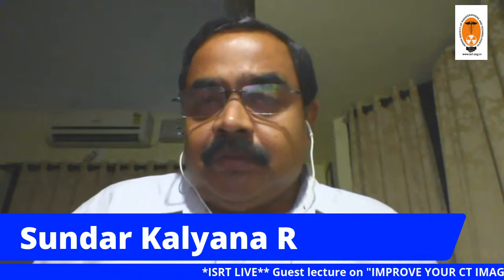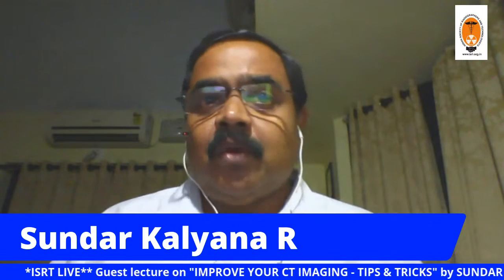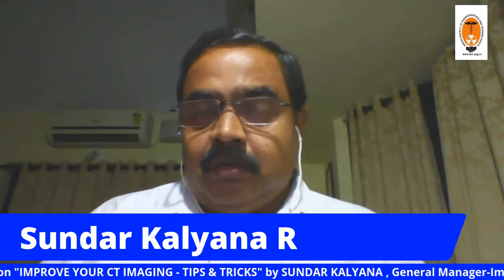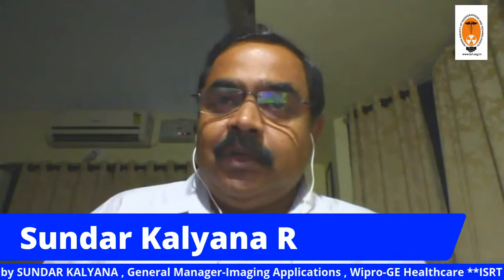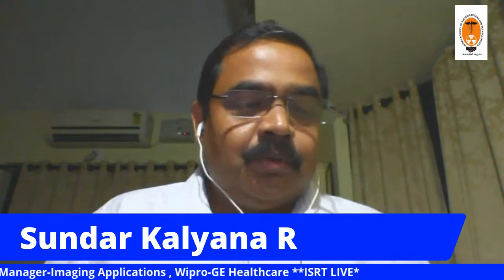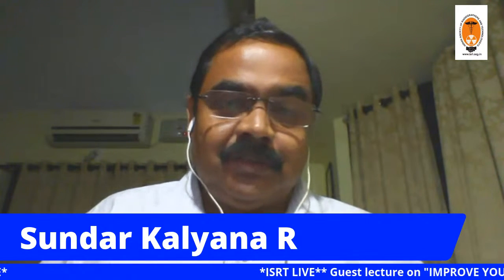None of the CT systems today can do a kV modulation during a single scan run. Why? Because modulating kV will change the Hounsfield unit. You cannot have the lower portion of the brain, with white matter having certain HU, and the higher portion of the brain having a different HU. So there is nothing called modulated kV during a scan today. All kV runs on a fixed level.